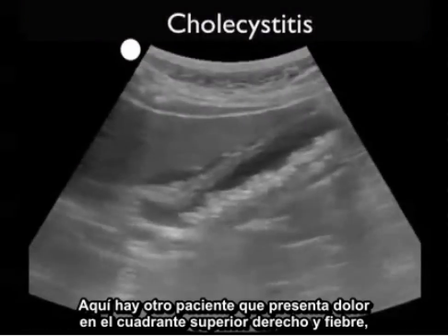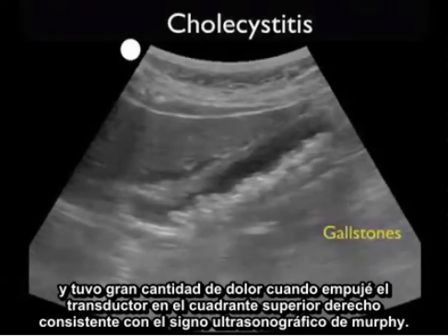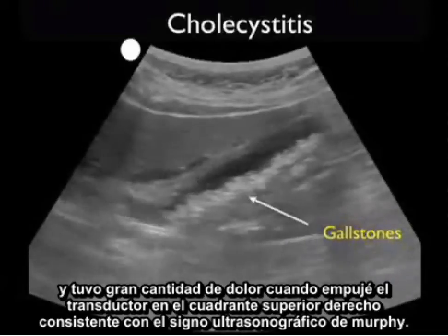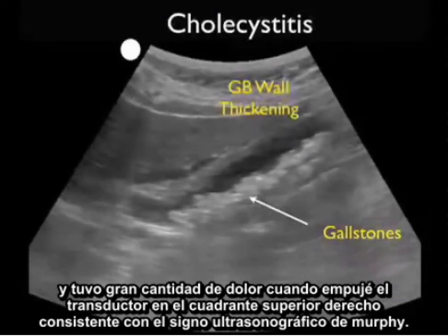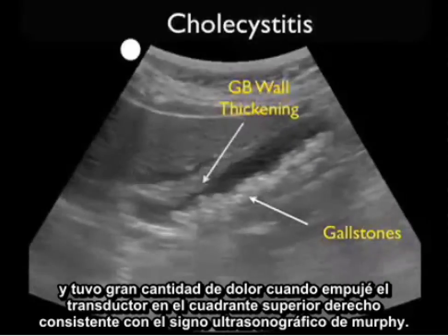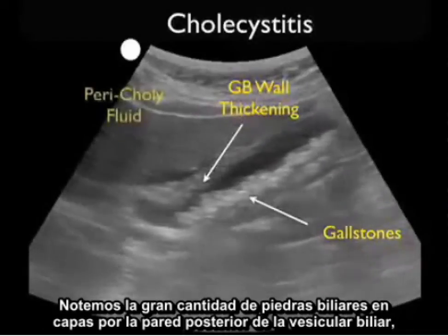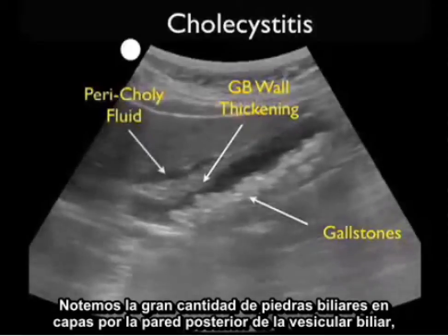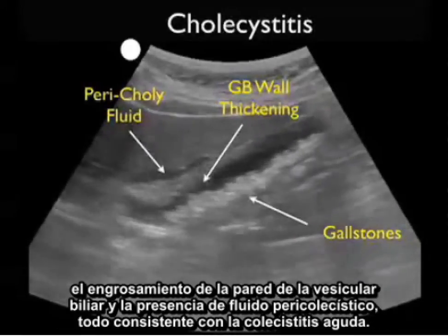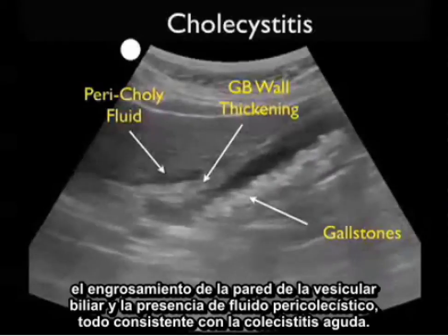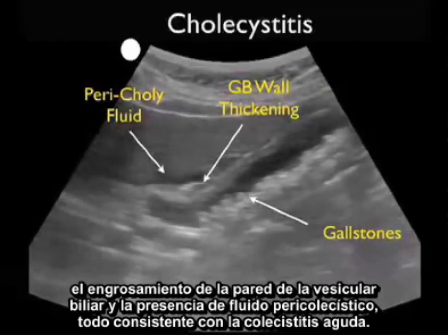Here's another patient who presented with right upper quadrant pain and fever, and had a great deal of pain when I pushed the probe into the right upper quadrant, consistent with a sonographic Murphy sign. Notice the large amount of gallstones layering out along the back wall of the gallbladder, the gallbladder wall thickening of the anterior wall, and the presence of pericholecystic fluid — all consistent with acute cholecystitis.